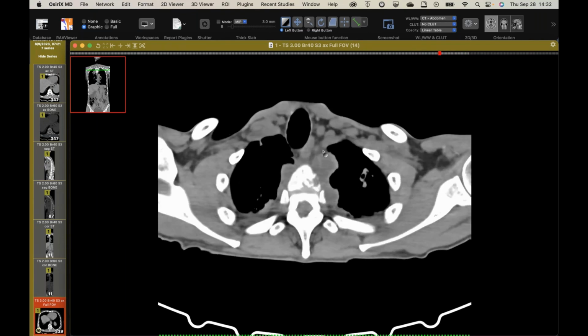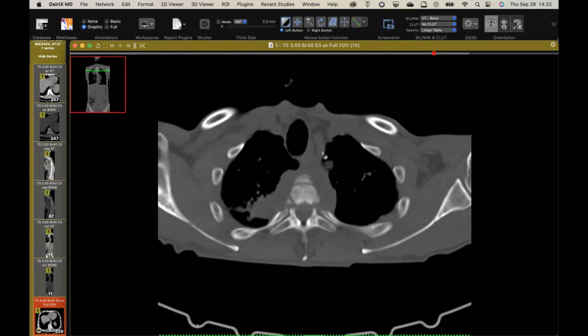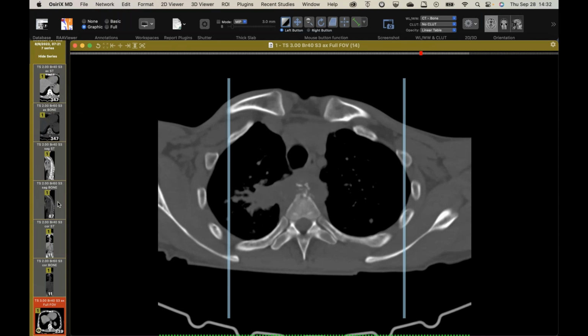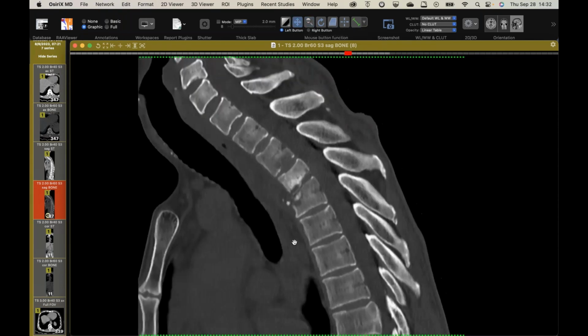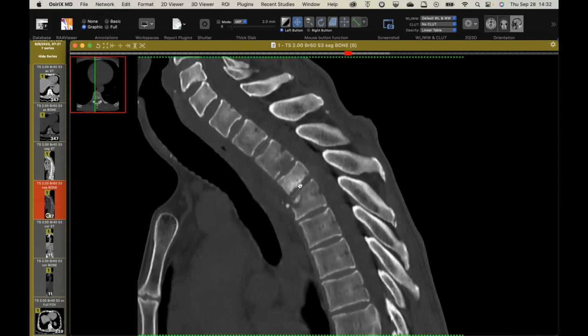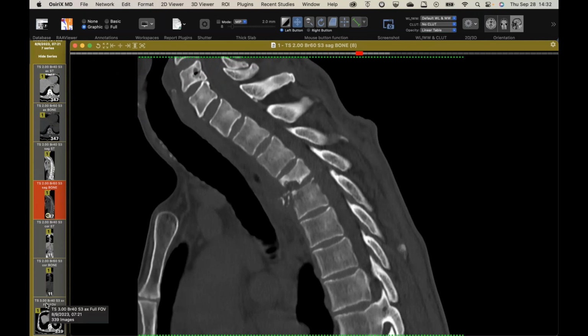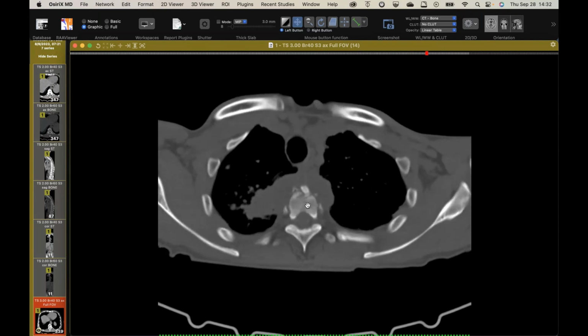And then you'll see as well, there's osteolysis of several vertebral bodies here, fragmentation. I'll show a sagittal on the T-spine reconstruction. There you can see this bone, this one's collapsed a little bit, and then you've got these multiple levels of osteolysis, but you'll notice the disc space is relatively preserved, which is pretty typical for this entity. So putting it all together, this is just a really nice example of disseminated tuberculosis with Pott's disease.